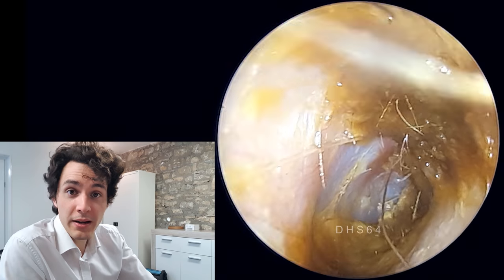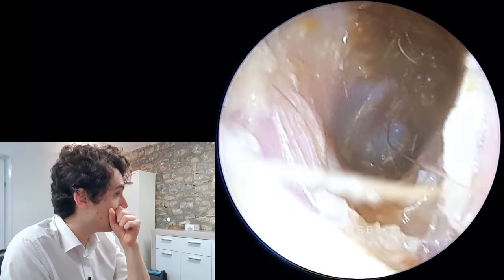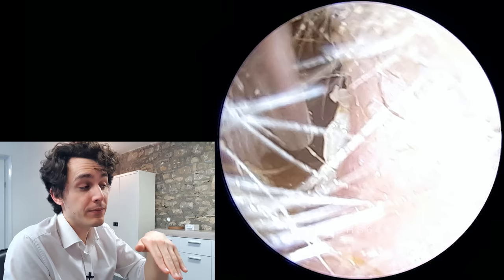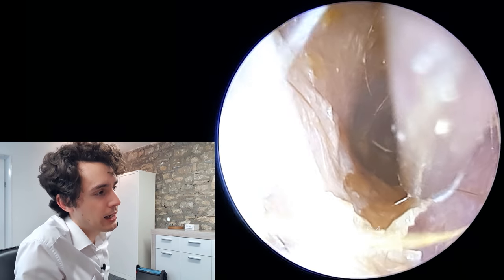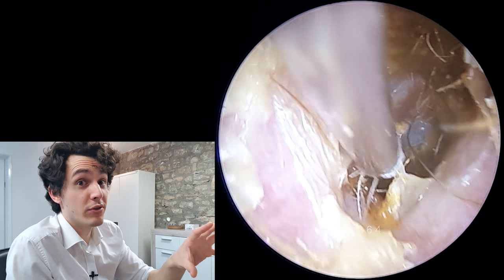In a similar way, you see sodium bicarb as a cerumenolytic, and anything with hydrogen peroxide in it. The idea is that the water solution will go in and hydrate the keratin — it will hydrate all the dead skin cells and they'll kind of break off and flake apart. So even with a very short exposure, it's already made a difference.